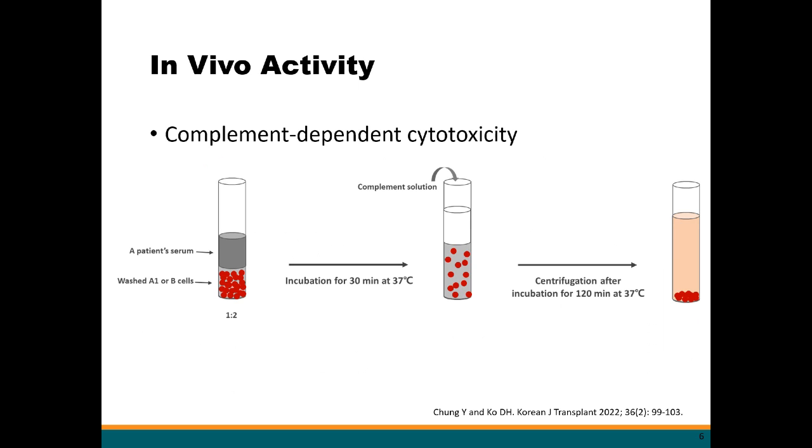Therefore, we tried to develop an alternative approach to reflect the in vivo activity of ABO antibodies. As I mentioned earlier, the complement activation step is the key step in ABO antibody. So, this is the basic scheme of the newly developed test.